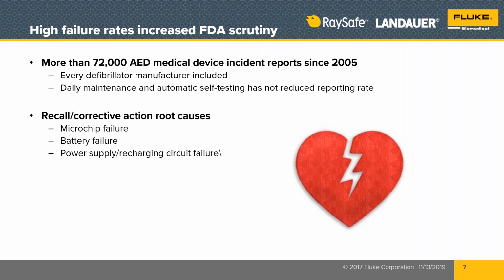So these defibrillators and AEDs have a rough and tough life. Some of them, like when they're in those vehicles, it's cold at night and the vehicle's outside in the cold, so they're getting frozen at night, and then in the daytime, in the middle of the summer, they're getting cooked sitting in the trunk of that police vehicle. So there are a lot more factors that need to be thought about and ways that they can be broken, other than just normal clinical usage of sitting there on the crash cart in case there's an emergency.